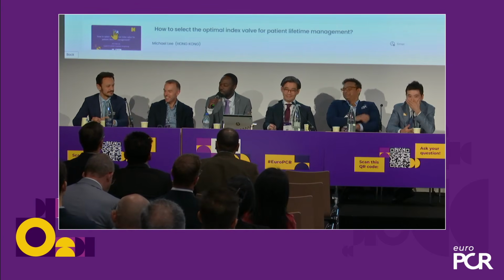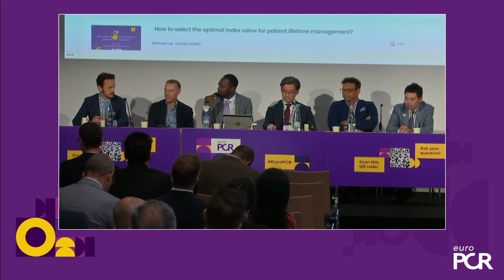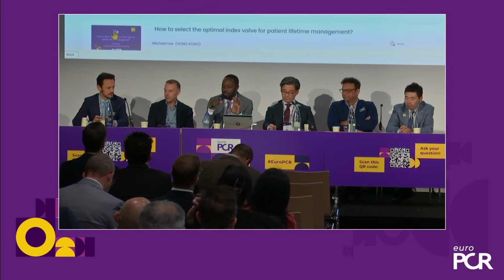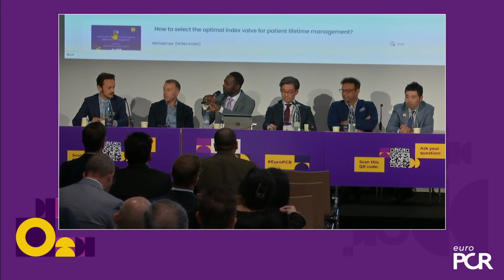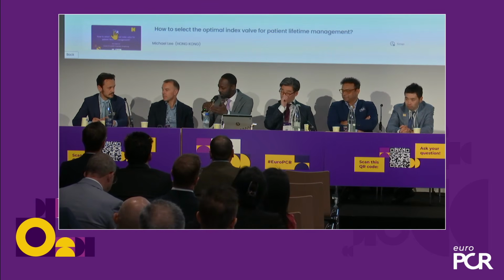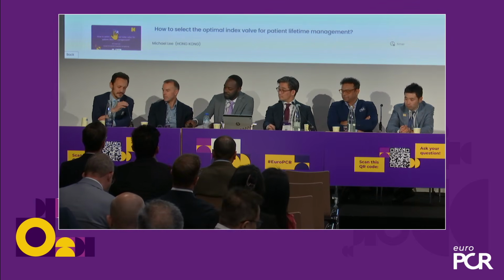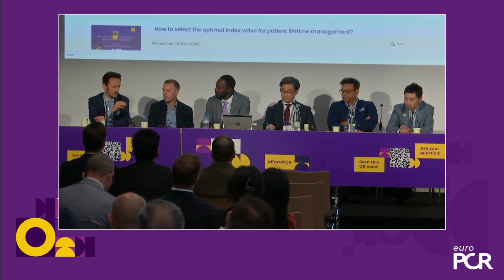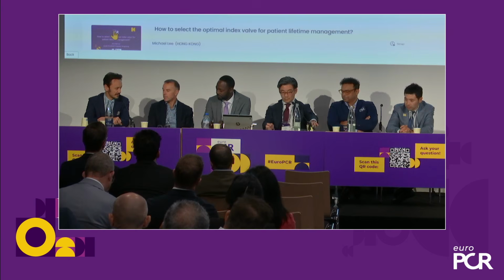We've seen the sequence that has been proposed by Mike, and I didn't see any explant. So should we say that we should never start with a TAVI procedure if we think that the patient is going to require surgery because it's too complex, or should we bring back explant within the algorithm? It's a good point. I think in principle, probably yes. If we think that the valve eventually should be explanted in the future, if you already plan an explant, then probably it's better to go for surgery right away.